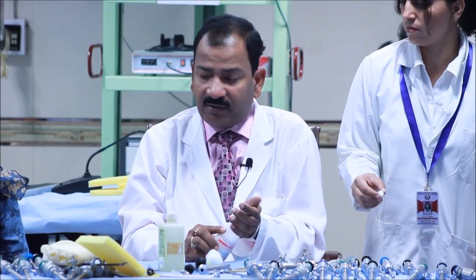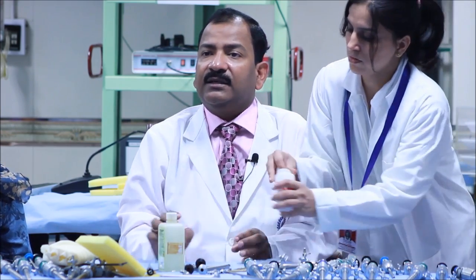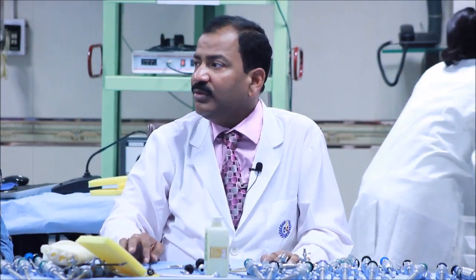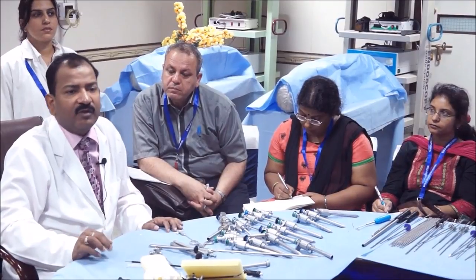So this is also one of the ways. Formalin tablets should ideally be used to keep the instrument sterile. It should not be used for primary disinfection. But at some places they use it for primary disinfection. If you are using it for primary disinfection, at least overnight it has to be sealed. Like in the evening, you clean the instrument with the rinsing water with the detergent, then clean with the alcohol, the spirit outside, then dry it, and then put it in the formalin chamber in the evening today, so that tomorrow morning you can perform the surgery. And instead of using the glutaraldehyde, you directly use the formalin chamber.